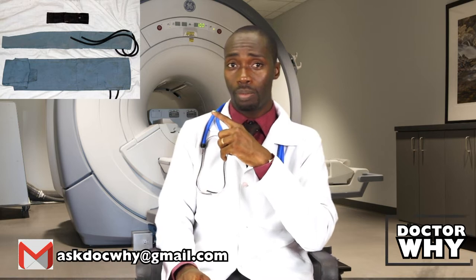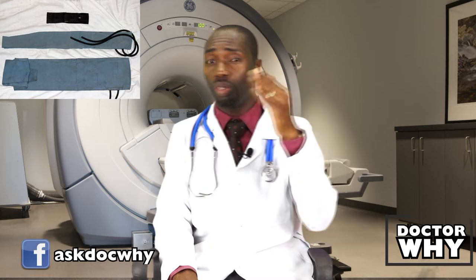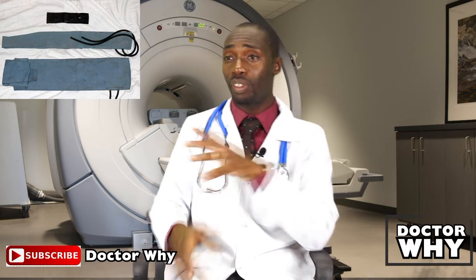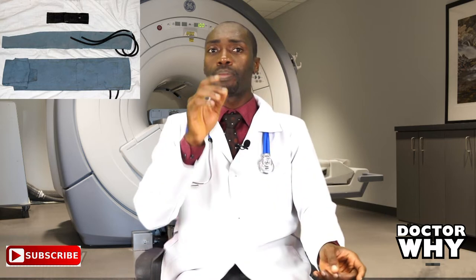These are examples of different cuff sizes. The first one is used in the hospital for checking blood pressure in babies. The second is used for children — around 2, 3, or 4 years old — depending on arm size. The last one is the type used for adults. There are also cuffs bigger than this for those with very big or fat arms. If you're buying a digital sphygmomanometer, make sure the cuff is the correct size for your arm.